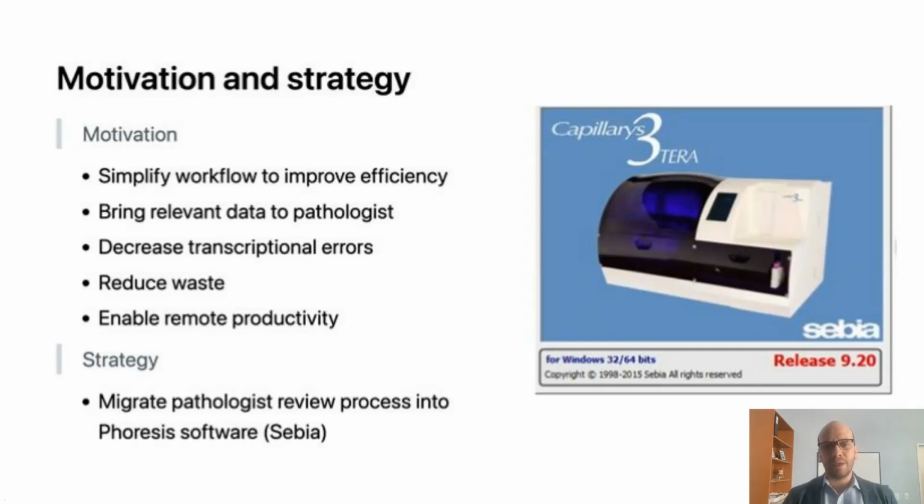So the strategy was to migrate the pathologist review process from the physical world into the Phoresis software. Phoresis is the software developed by Sebia that triggers the instrument and collects the data.